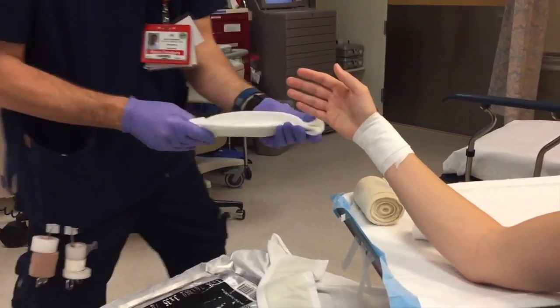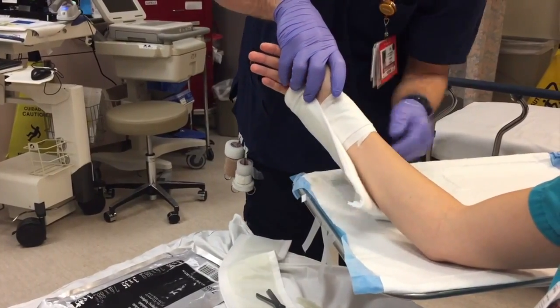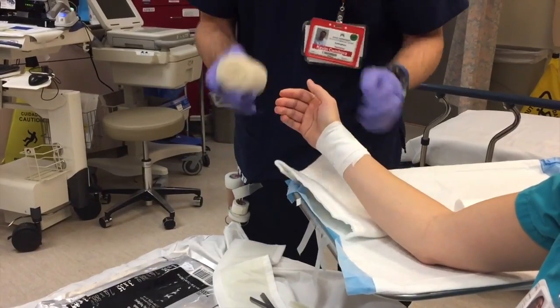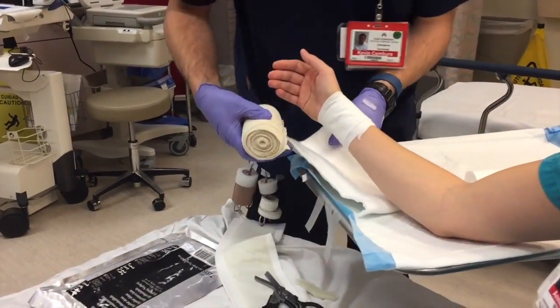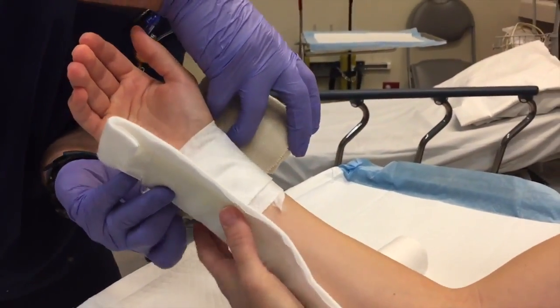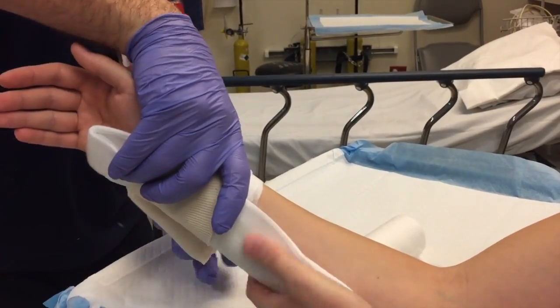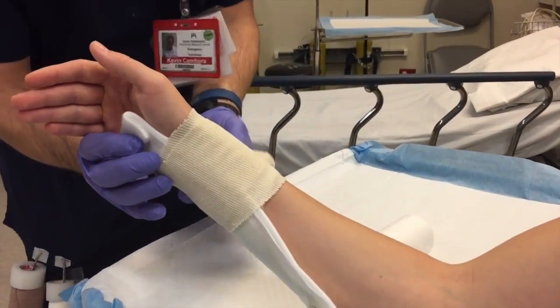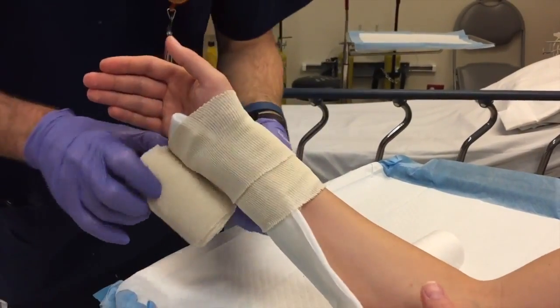Also, just a second, what Kevin's saying: if you don't use any water at all, the process for it to cure and harden will take about 45 minutes. When you put water, it takes anywhere between 5 and 10 minutes, and at that point it's still malleable before it completely hardens. So you want to make sure during that time frame, while you're putting this on, that patient comfort is optimized using some of the techniques that Kevin demonstrated, like getting rid of all the wrinkles or any folds, and also putting that one piece of padding right there at the bony prominence. That does wonders for the patient. And sometimes it will be beneficial to have somebody help you hold a splint like this on the patient.